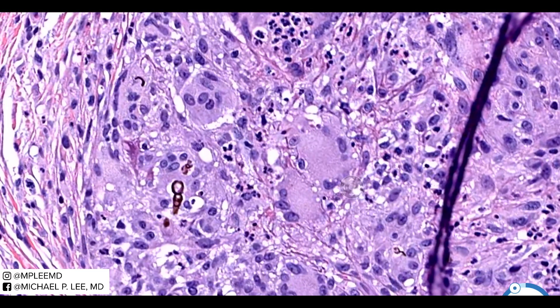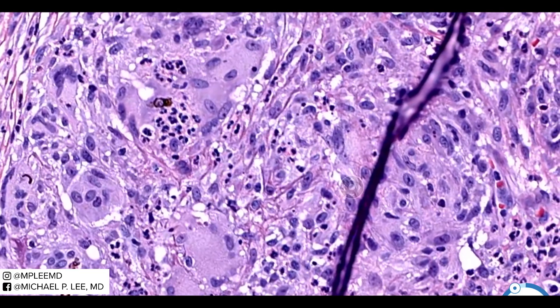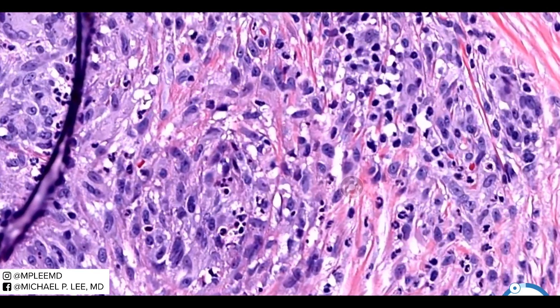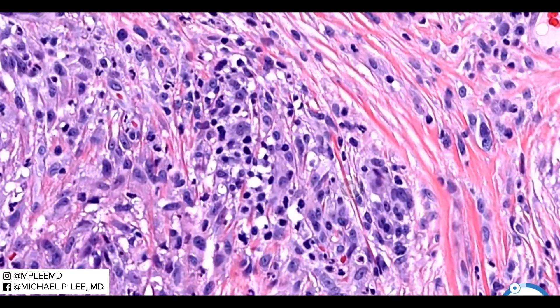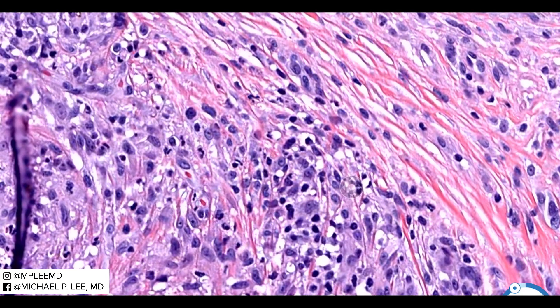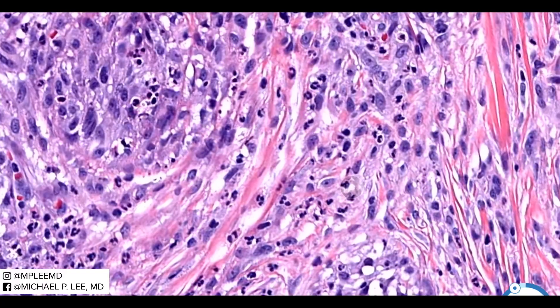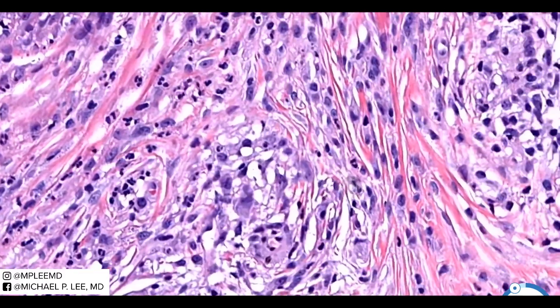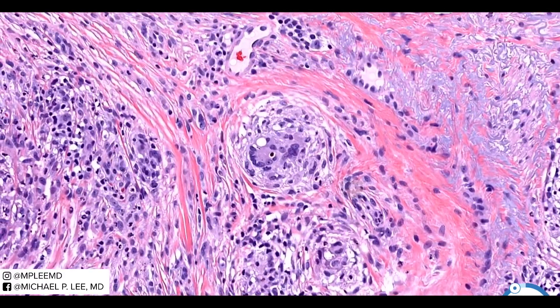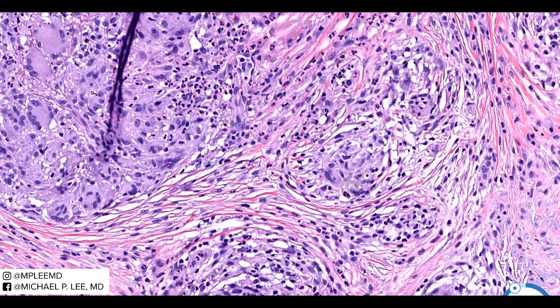Now, if these things were not pigmented, another entity you would want to think about is — if they're just little round bodies stuck together — you want to think about lobomycosis as well, if they are not pigmented. For board purposes.